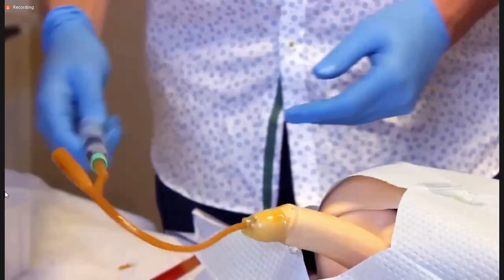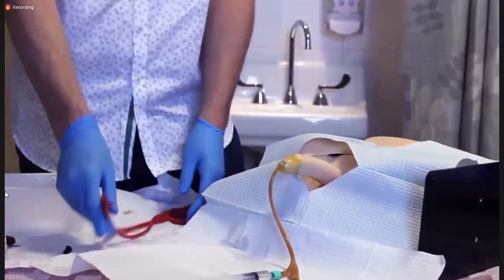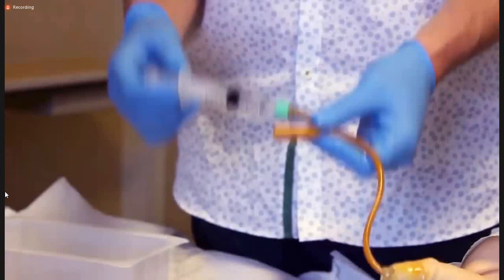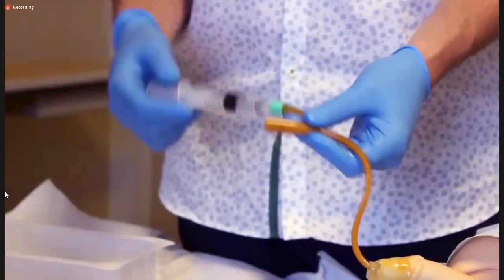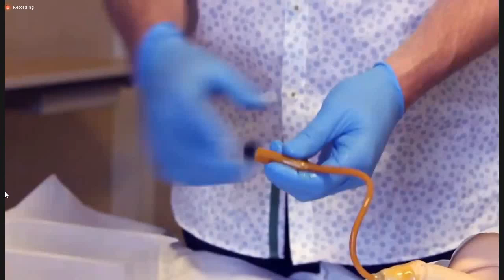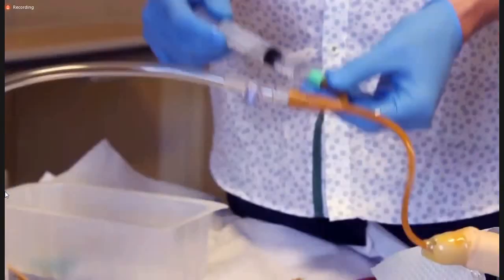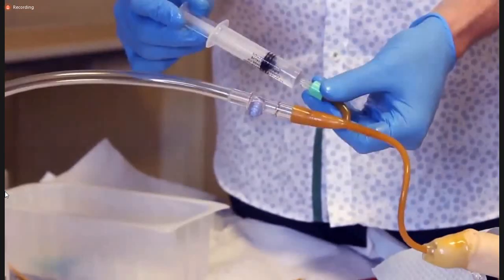There are different types of catheters that we have available. In this case, the catheter that we inserted is commonly called a two-way catheter or Foley catheter. This one, just to review, has a drainage port that, again, you'll hook your catheter bag up to, and the other port, the second port, is to inflate the catheter balloon.